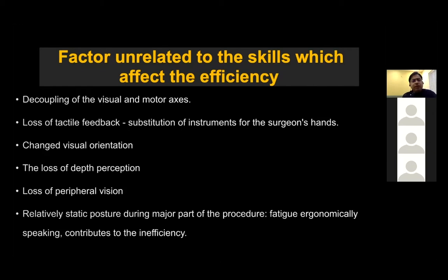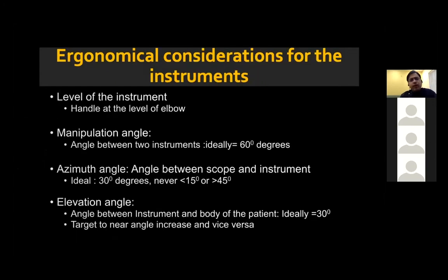You keep standing for a long duration. This leads to pain, fatigue, and decreased efficiency. So these are the issues with laparoscopic surgery. Now, when you are considering any laparoscopic surgery, what is the most important thing that will allow you to work over a period of long duration is ergonomic comfort.